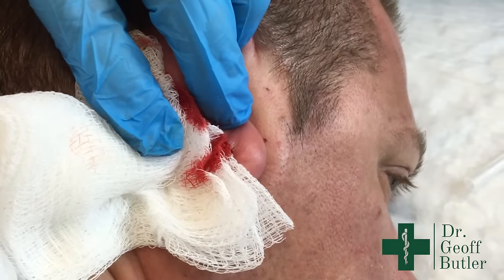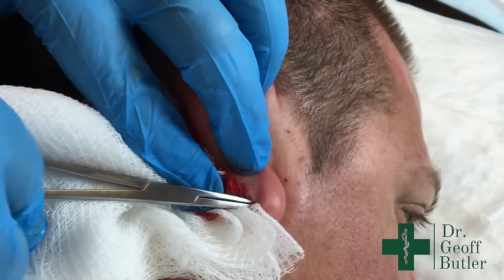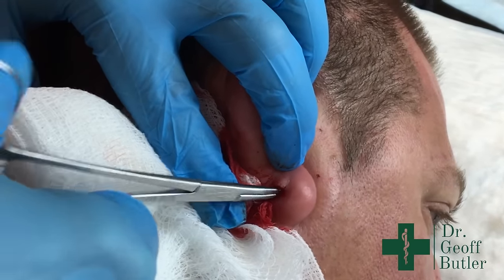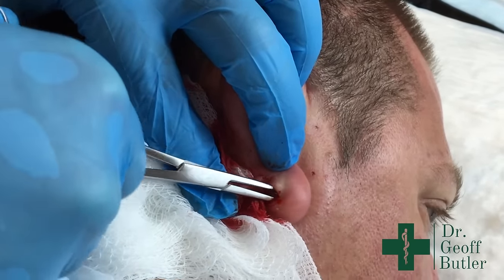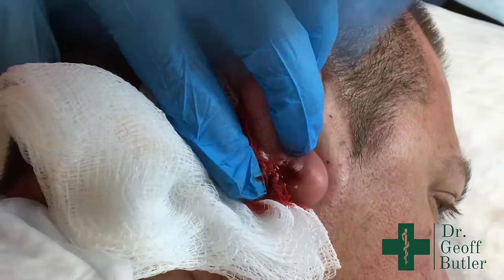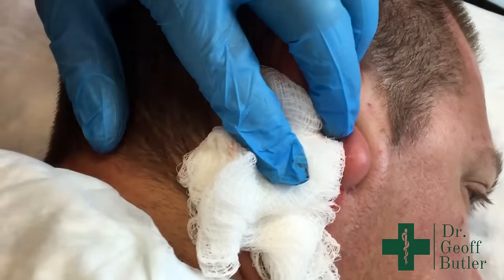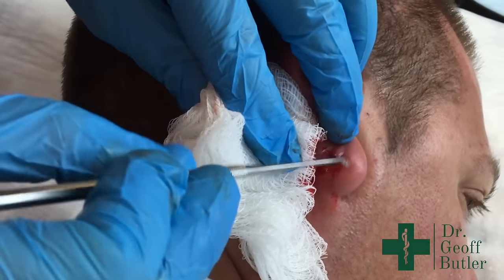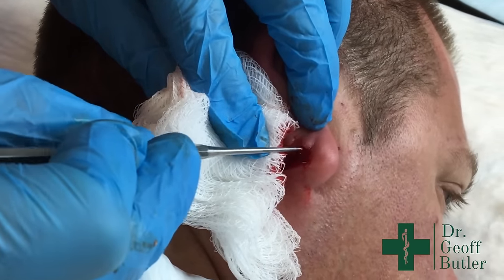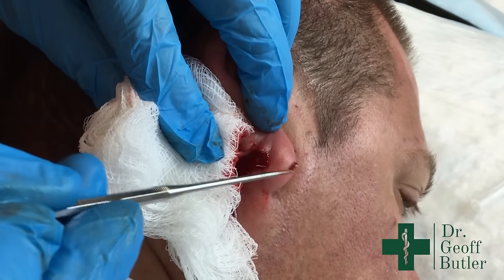Once I've opened that up, I use a bit of blunt dissection just to see if I can break down some loculations — it won't get a lot, but just opens it up a little bit. Then I'll do the same thing with a small curette, just scraping the wall a little bit. There's a little bit of debris there.